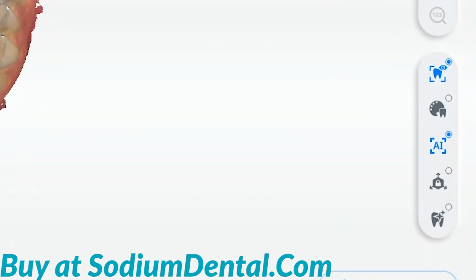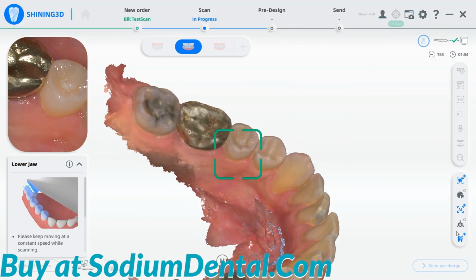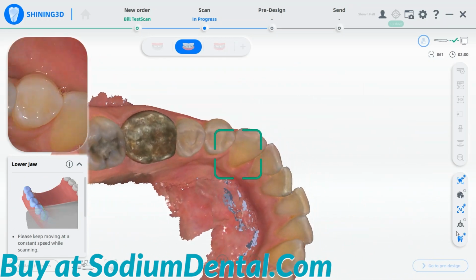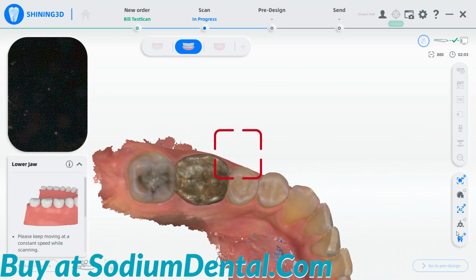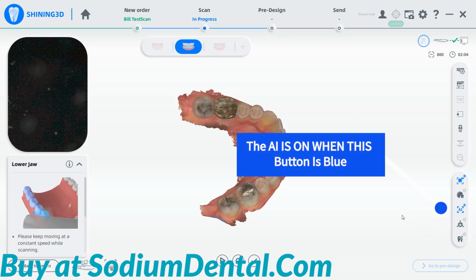If the patient has a large gold crown, you may want to use the Metal Surfaces tab. You may find that will assist you if there are a great deal of very shiny full crowns in the mouth. You also always want to make sure that your AI is on unless you are scanning edentulous scans.